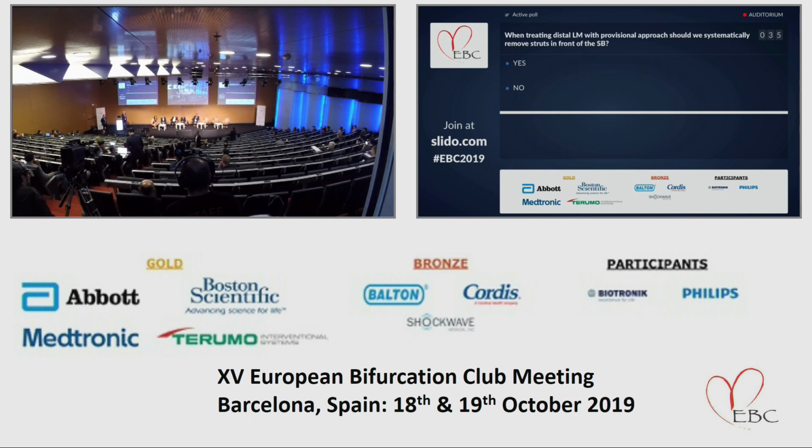Yesterday in the complication cases, you can find the slides on the web if you were not present. There are three or four cases, because now we have imaging. You have a left main, no kissing, no opening, and then at the follow-up you see some haziness at the ostium of the circumflex. Now you go with your OCT, and in three consecutive cases there was not only one opening, but two or three openings.